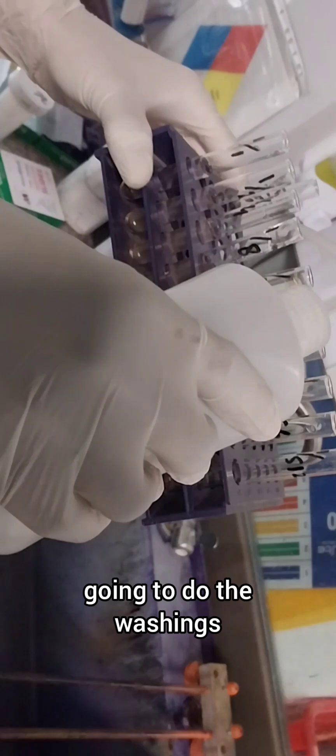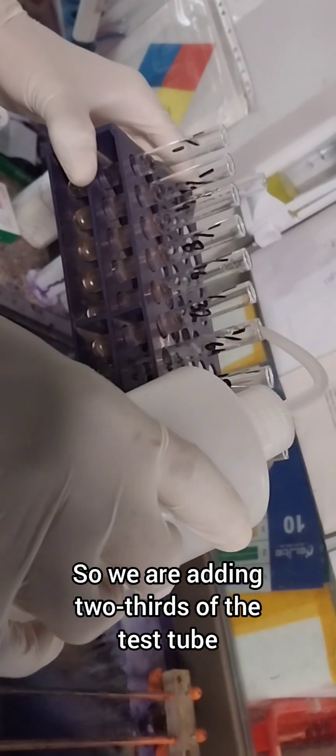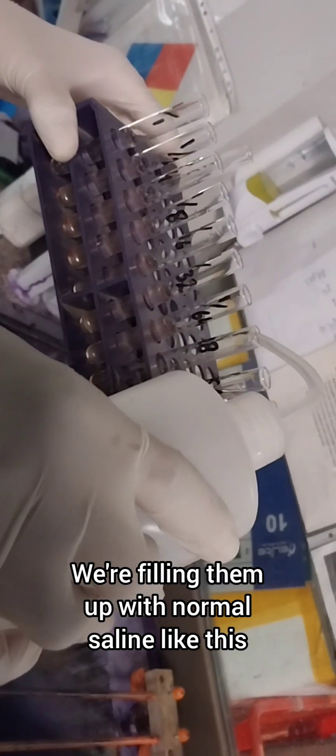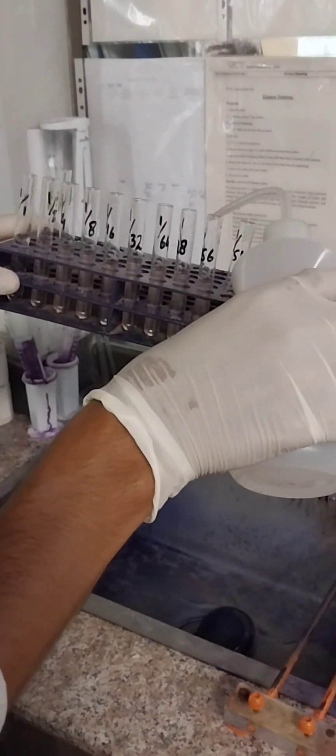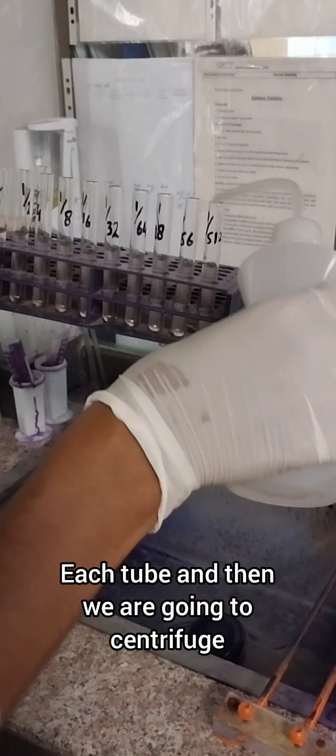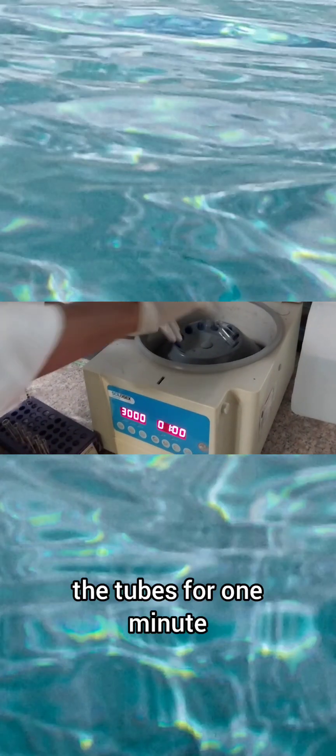After taking the incubation period, we are going to do the washings. We are adding two-thirds of the test tube, filling them up with normal saline like this, each tube. Then we are going to centrifuge the tubes for one minute.